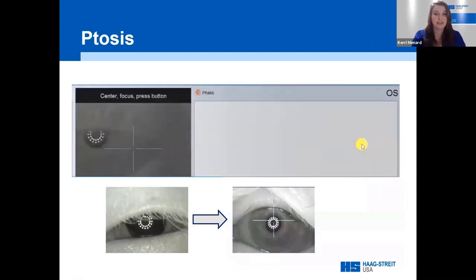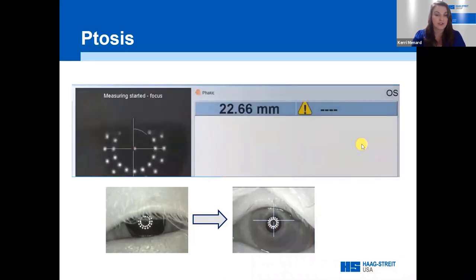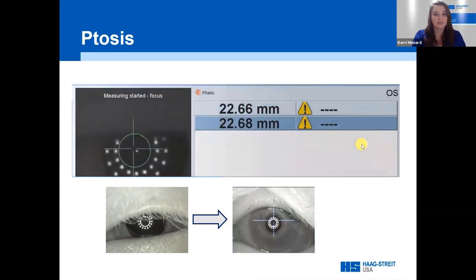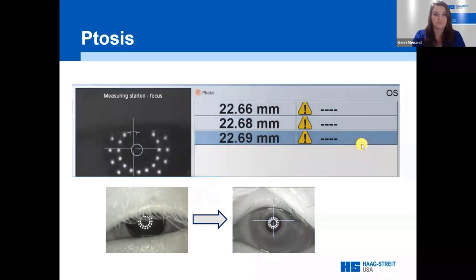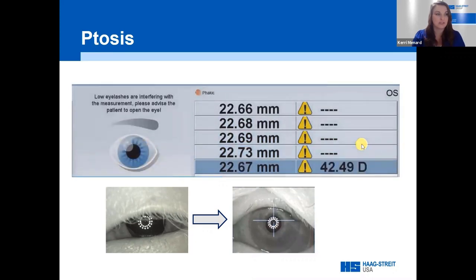If during measurements a patient's eyelid or eyelash limits the number of data points, the LenStar will be unable to acquire accurate keratometry measurements. Instruct the patient to open wide. If they cannot open wide enough on their own to visualize those 32 keratometry points, the technician may need to carefully lift the eyelid — but be careful not to induce pressure on the eye itself. Only use the excess skin on the supraorbital ridge under the brow bone. If holding the upper lid causes dryness, allow the patient to blink as needed, then re-pick up the lid.